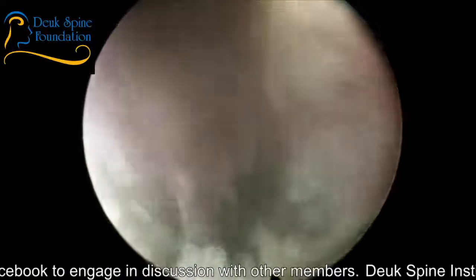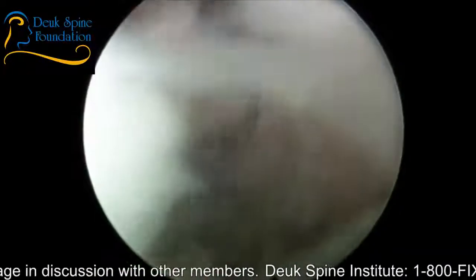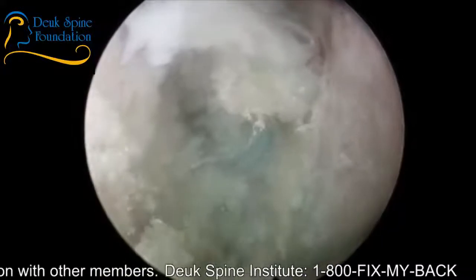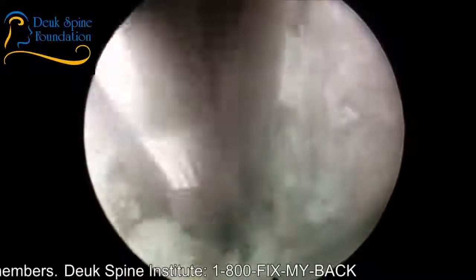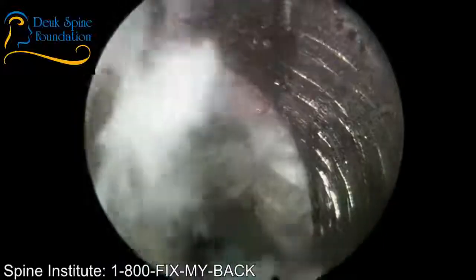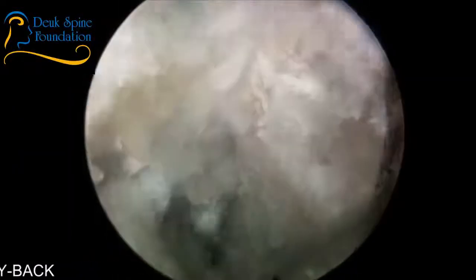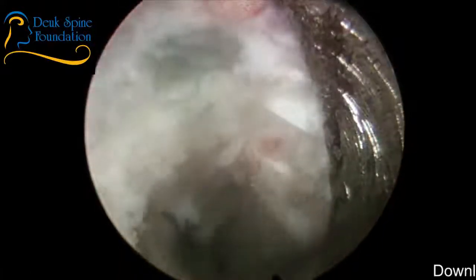Any questions from our audience? None currently. All right. Well, we are just about done with this disc. And there's a piece of herniation right there. Just came out. Let's see if I can grab it. It's misbehaving. Come on out. Nice.